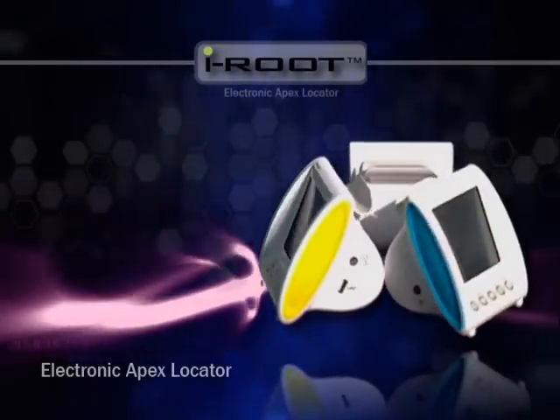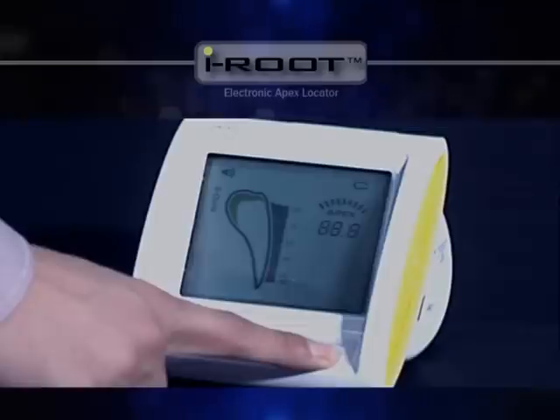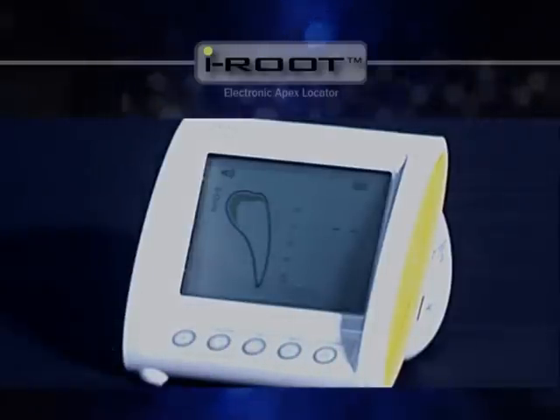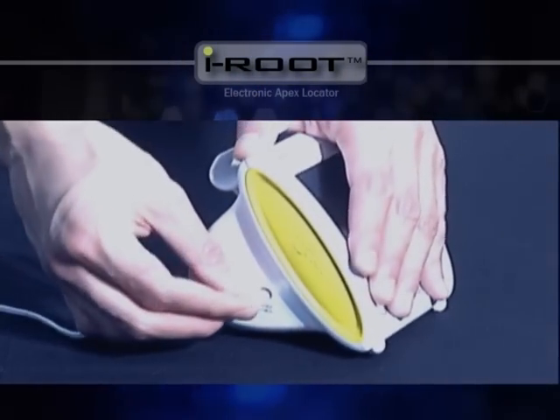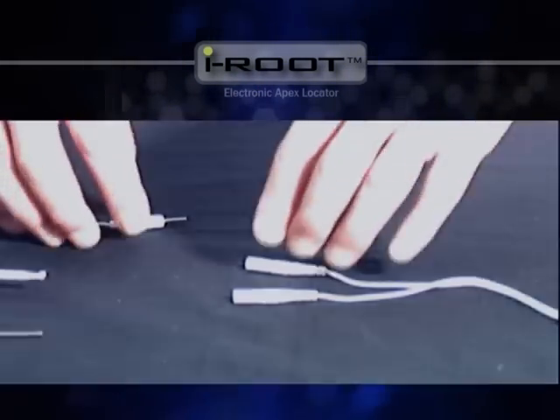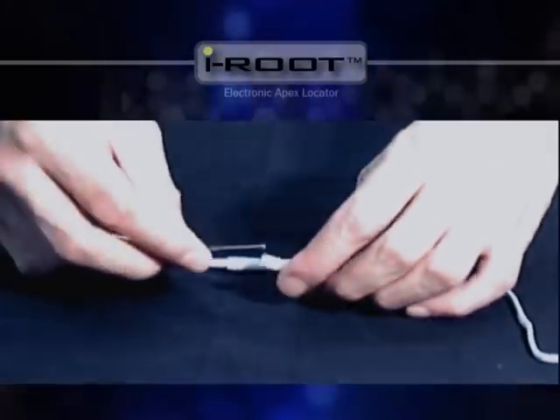Now we'll see what you need to prepare before using iRoot. One: check if the LCD screen works fine when the unit is on. Two: connect the probe cord and connect a lip clip and a file holder to the two ports of the probe cord.